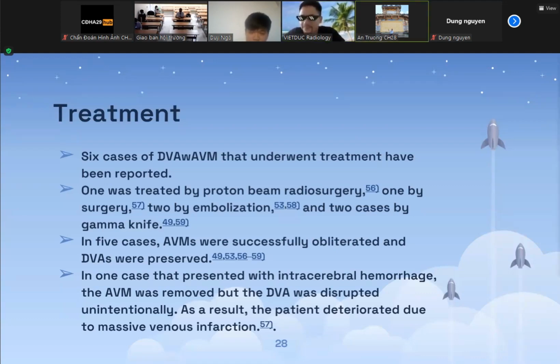Dr. Hung, I have a question. Sorry, your internet is unstable and I can't hear your question clearly. Can you repeat it, please? Yes, I wonder, when we read a conventional MRI of the brain, if we see a DVA, should it be described or just detected and passed over?